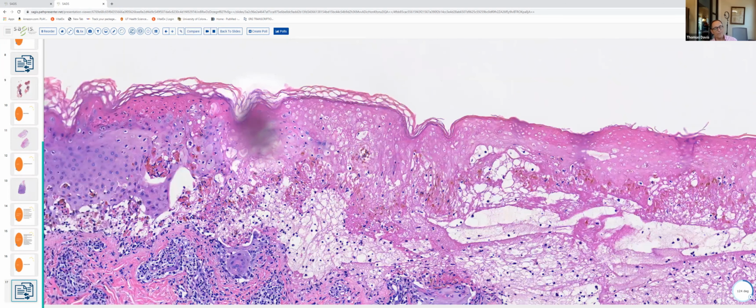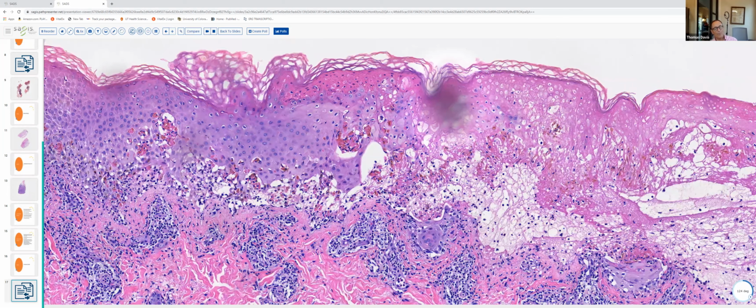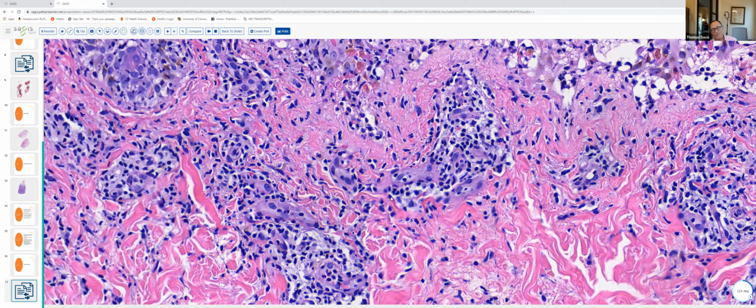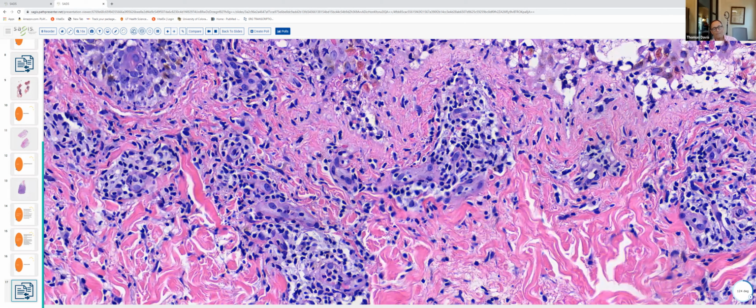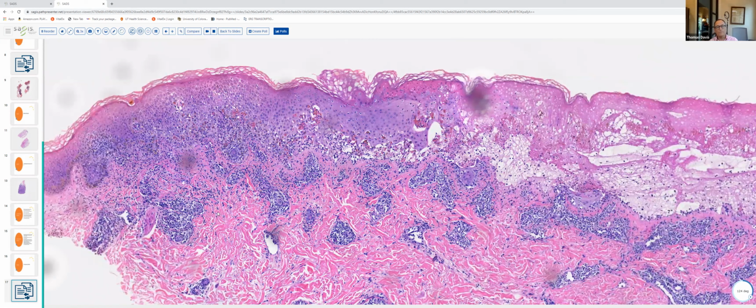If we look at the edge of the specimen, again, we've got vacuolar change along the DEJ, a little bit of a lymphoid infiltrate obscuring the dermal epidermal junction. And we've got clusters of necrotic keratinocytes within the epidermis. So a little bit of pigment dropout within the underlying dermis. So we've got lymphocytes and scattered melanophages. And these features are very characteristic of Erythema multiforme. So with Erythema multiforme, we like to see a basket weave cornified layer, vacuolar change along the DEJ in concert with necrotic keratinocytes in the epidermis and a superficial perivascular infiltrate of lymphocytes.